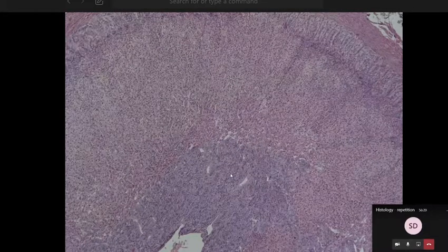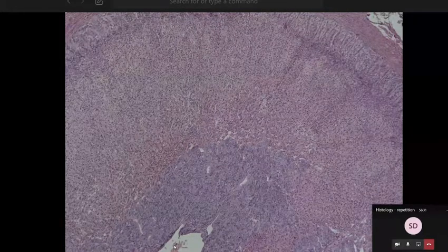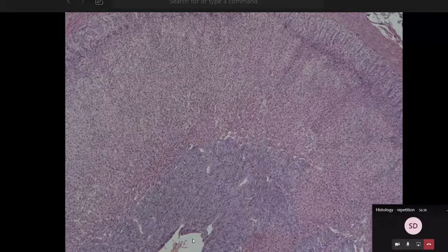So the violet part, this is the medulla. In the center of the medulla, we have the vein. This is not an artifact, this is a vein anatomically located there, it's correct, okay? You have the blood inside, some endothelial cells, so for sure you have a blood vessel.